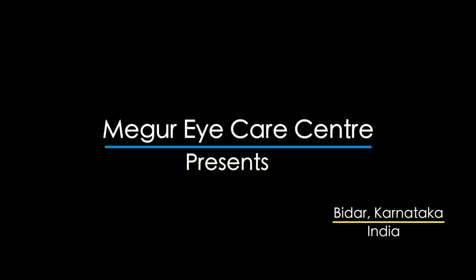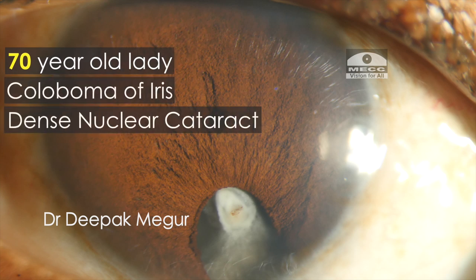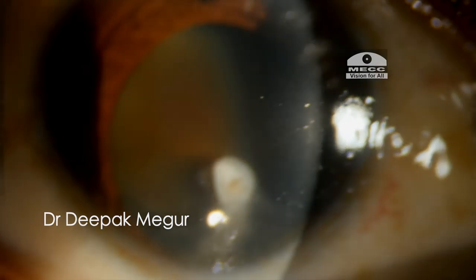Hi, this is Dr. Deepak Magur and today I am here with yet another interesting case. This is a 70-year-old lady with coloboma of the iris and a dense nuclear cataract which is almost grade 4 to grade 5, with a small calcified speck on the anterior capsule.